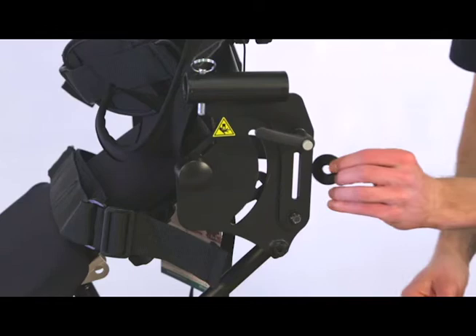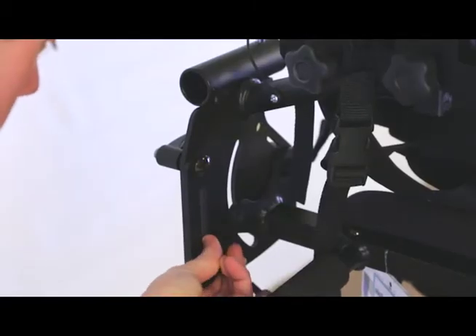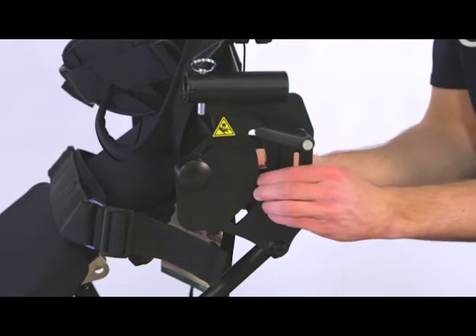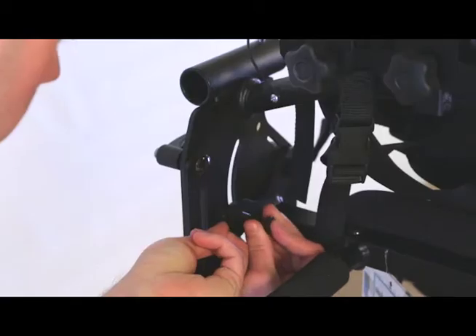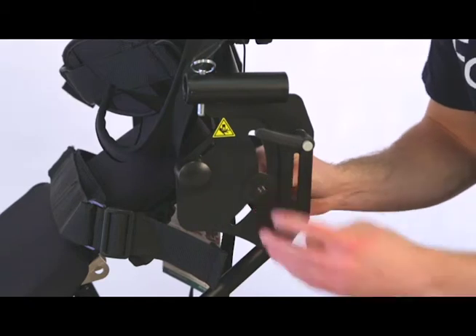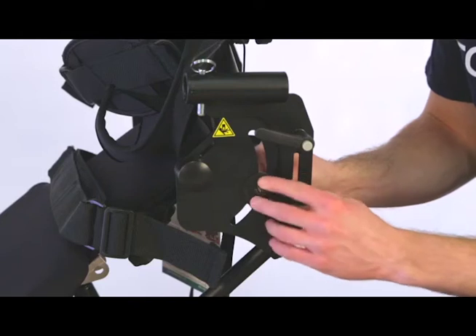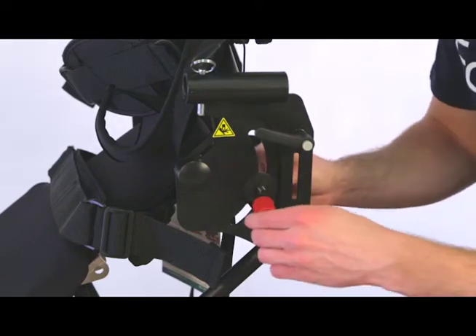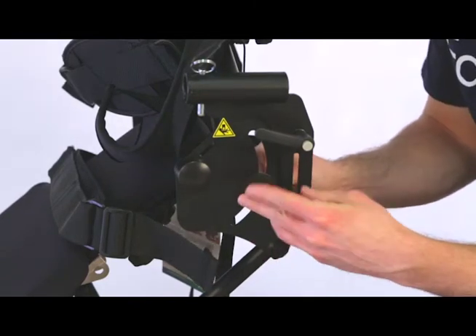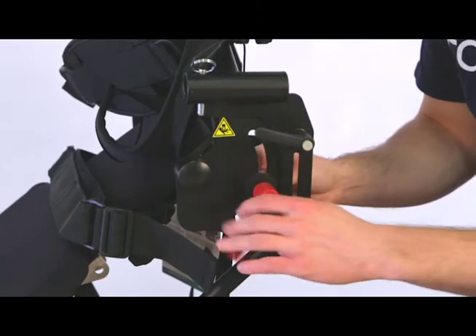To assemble the supine option, insert nylon washer in between the brackets as shown. Insert the bolt into the square hole, making sure the bolt is all the way in. Place beveled metal washer onto the bolt with the domed end facing outward. Place a small metal washer onto the beveled metal washer. Place the red supine locking handle onto the bolt. Repeat for the opposite side.